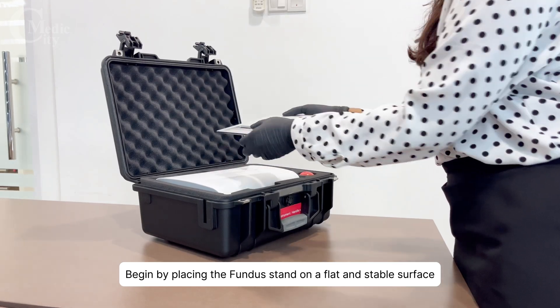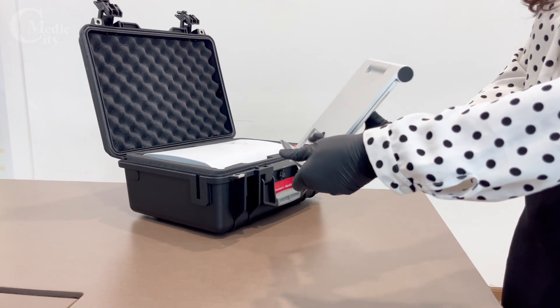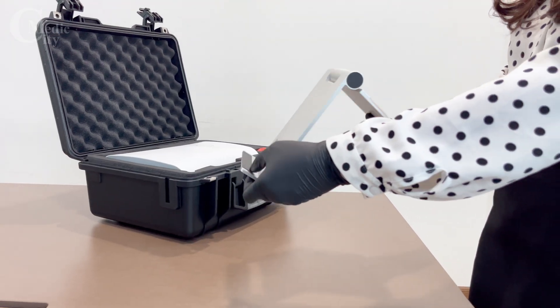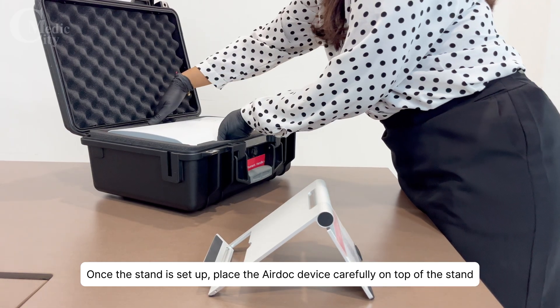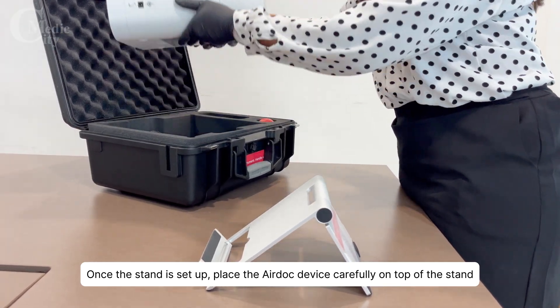Begin by placing the Fundus stand on a flat and stable surface. Once the stand is set up, place the AirDoc device carefully on top of the stand.